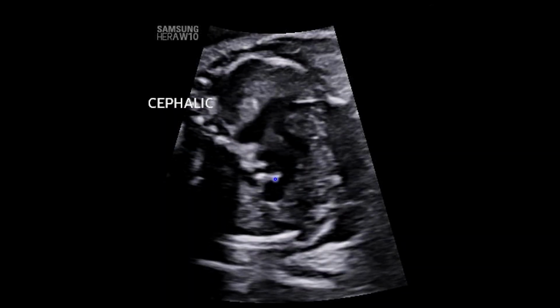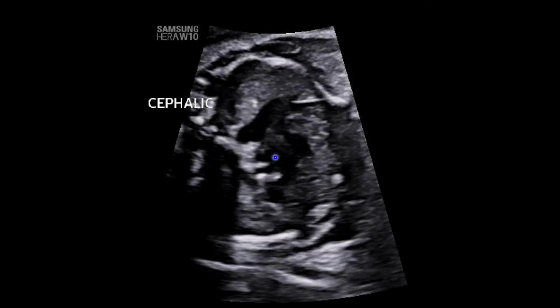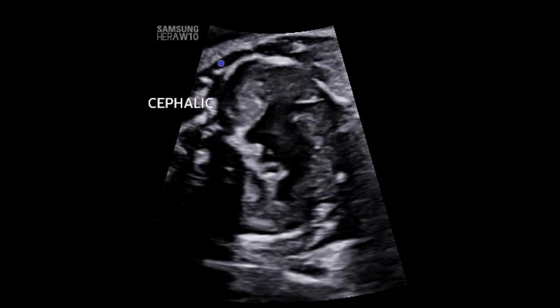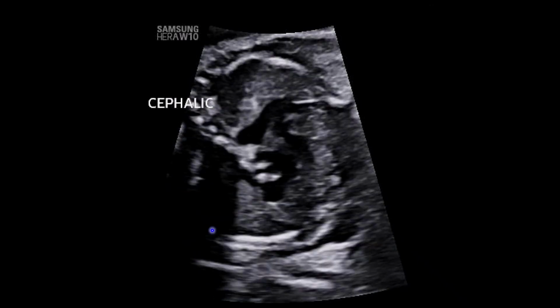Now this is also a normal three-vessel tracheal view. It may not look normal, but you have anterior here. This is the front of the fetus. This is the spine. And so this is the left back of the baby. This is actually the left side. And this is the right side.